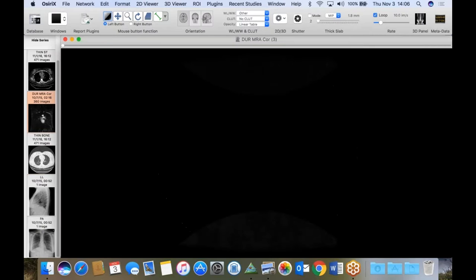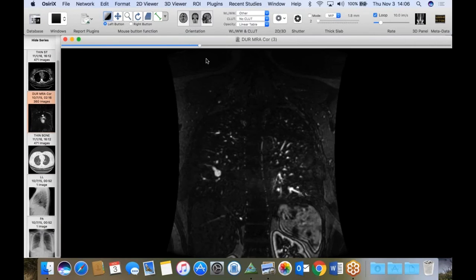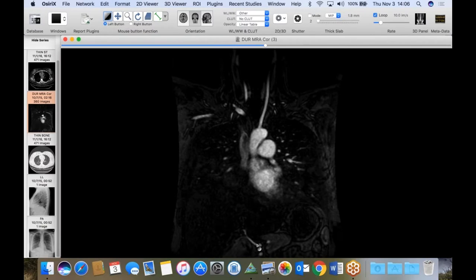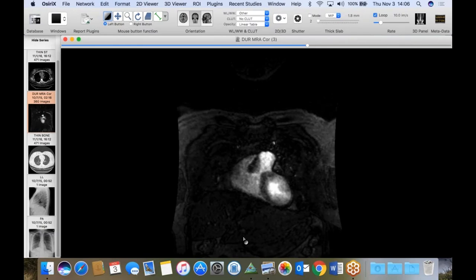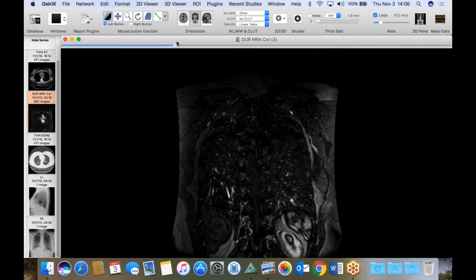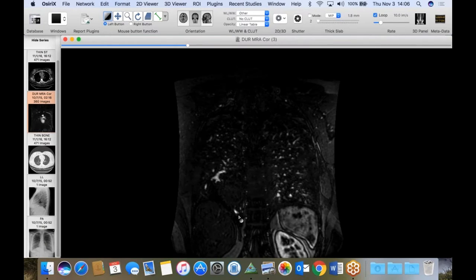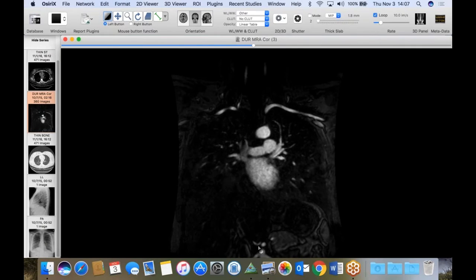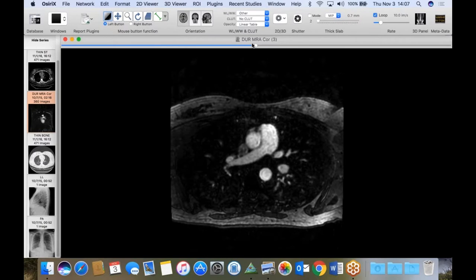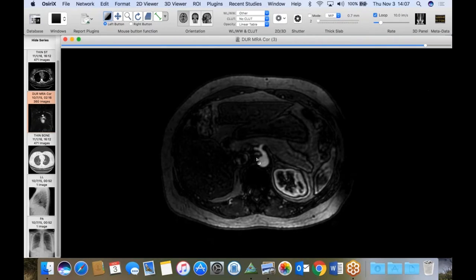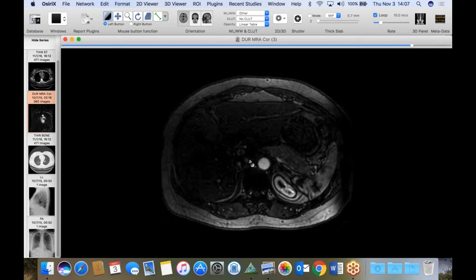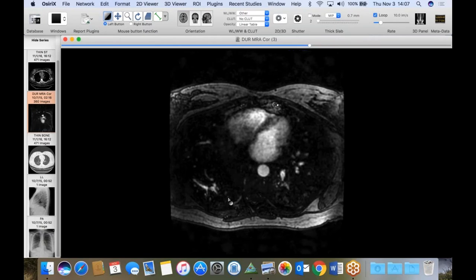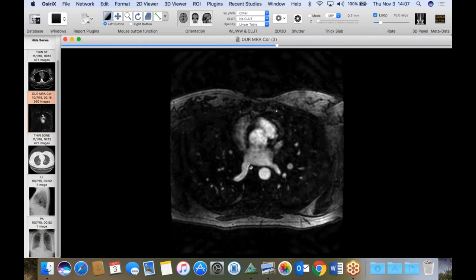With the diaphragmatic hernia and these vessels, it makes you think of a scimitar spectrum without the scimitar vein. The MRA from about a year ago really shows what these vessels are. Going anteriorly, we can follow this vessel coming off the abdominal aorta, through the abdomen, communicating right here, hooking back up and coming into the abdominal aorta. On axial, here's the celiac, and it's a little branch coming right off the aorta that courses along the diaphragm into the right lower lobe. Then we can see the funny draining vein plugging right into the left atrium.